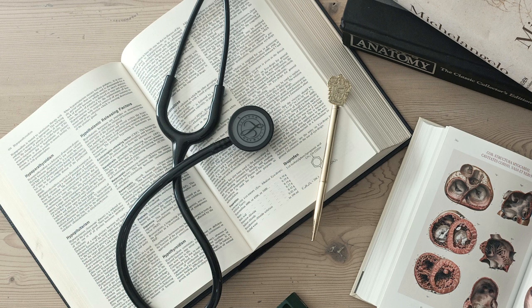So if the P wave and PR interval are both completely normal, meaning the atria and the AV node are functioning correctly, but we still see an arrhythmia, then where do we look for the source? That leads to rule number 4. If the P wave and the PR interval are both normal, meaning the atria are depolarizing properly, and the AV node is conducting impulses through correctly, but you then see very large abnormal QRS complexes, the arrhythmia's origin must be ventricular.